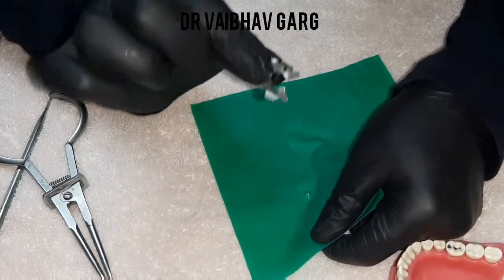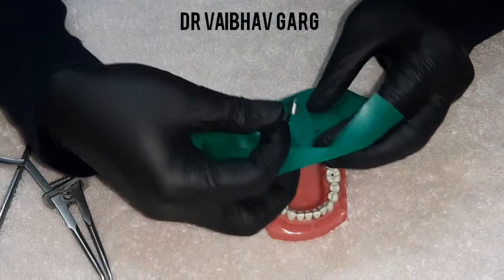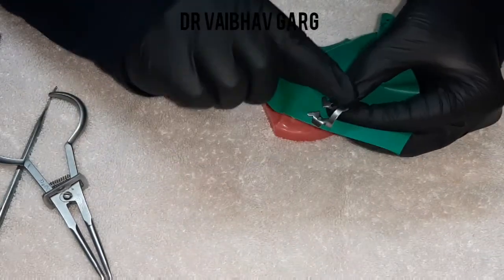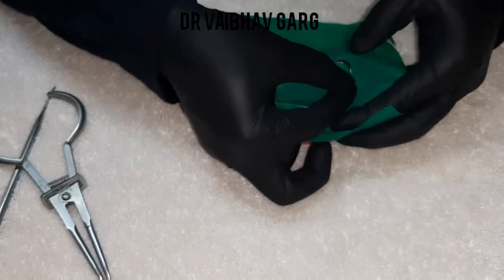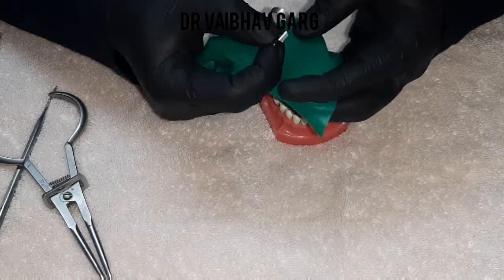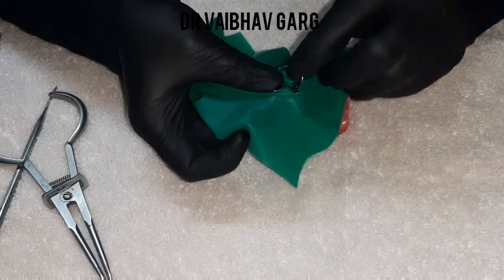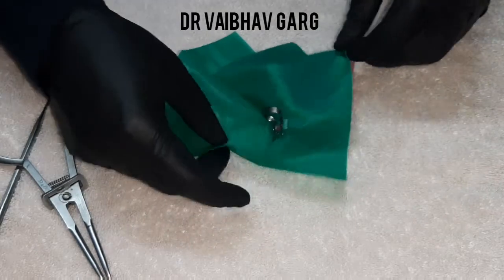Please look carefully at what I am doing with the clamp and the sheet — this technique is very useful. My sheet will come here and the orientation of the ring of the clamp should be on the back side, towards the second molar. I orient my sheet, place one wing, stretch over the other side, and just place it this way — it becomes very easy.